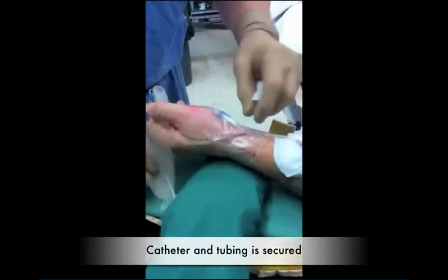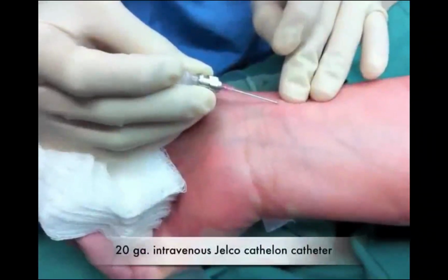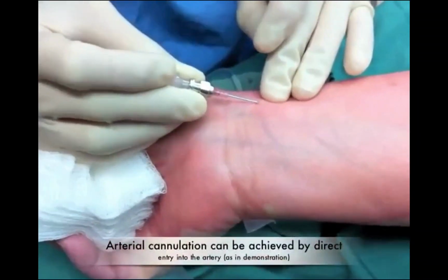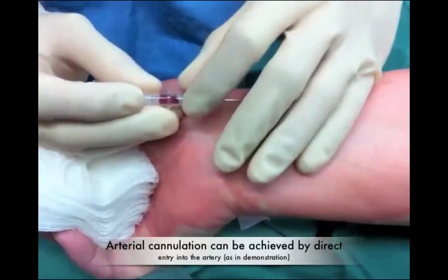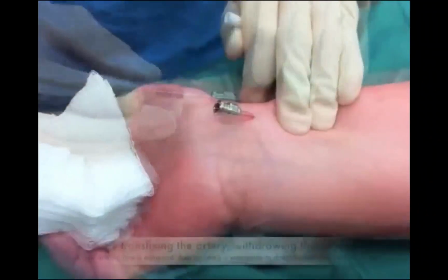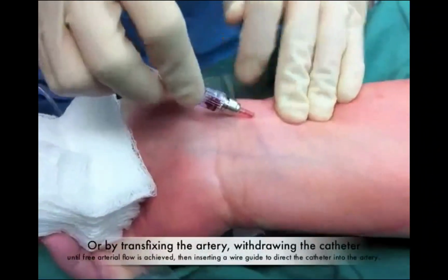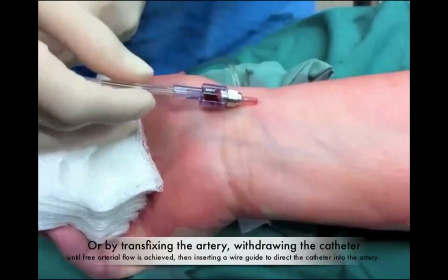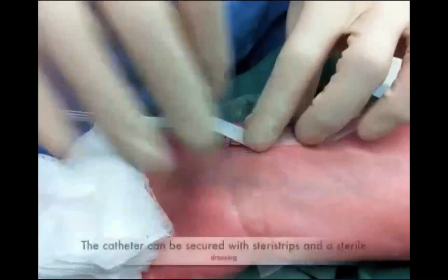A simple Cathlon catheter can be used to establish an arterial line. With blood return, the catheter angle is decreased and the catheter rotated off the needle into the arterial lumen. Alternatively, the artery can be transfixed with a through and through puncture. The needle is removed and the catheter is slowly withdrawn until pulsatile arterial flow is achieved.